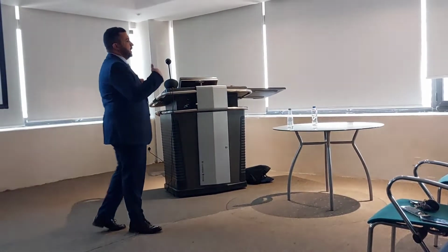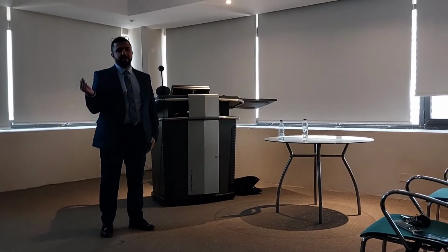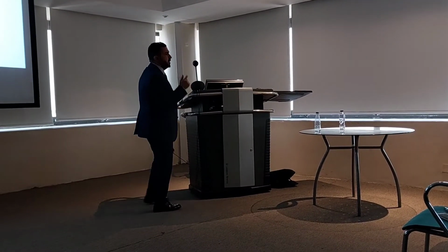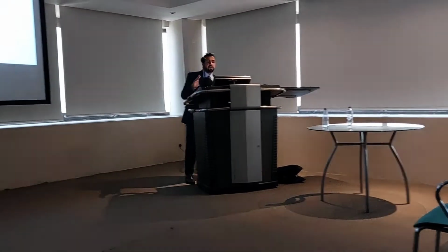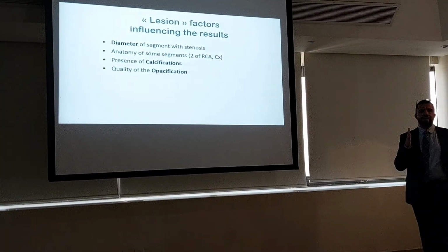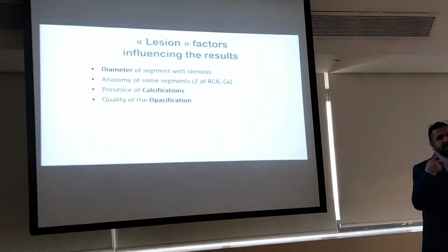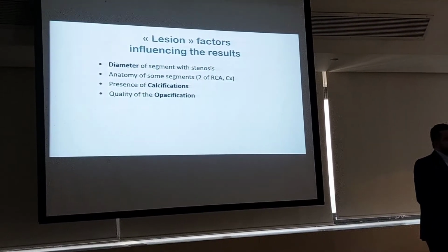Now with new machines, we have HD, high definition. That's really reducing the blooming artifact in a good portion, in all angles and especially in cardiac. Now we have the quality of the contrast opacification. If you are not really controlling the timing of the injection and the flow rate of the contrast, that will affect the quality.